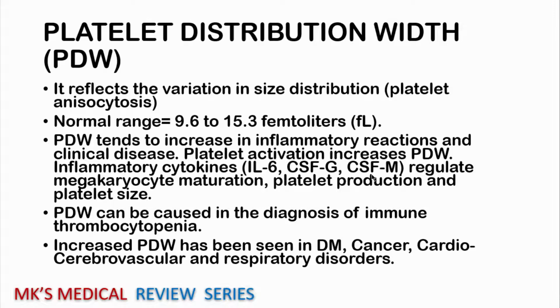So remember that the platelet distribution width is going to increase in inflammatory reactions. And this should make sense, because when platelets are activated, they are going to swell up. So if there is an inflammatory reaction and a clinical disease, this is going to lead to platelet activation, and this is going to increase the platelet distribution width. So the platelets are going to be much larger in size.